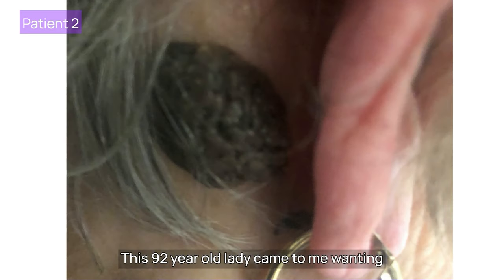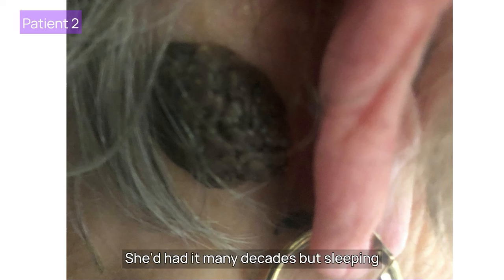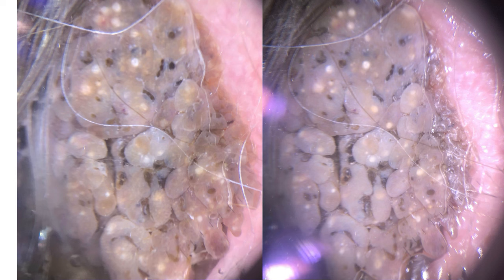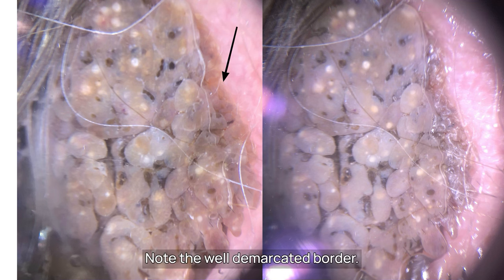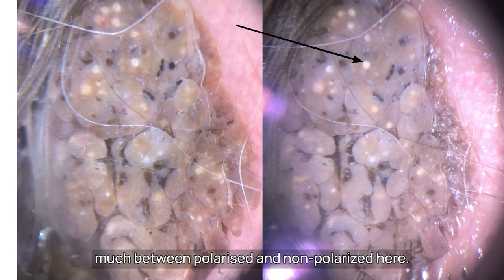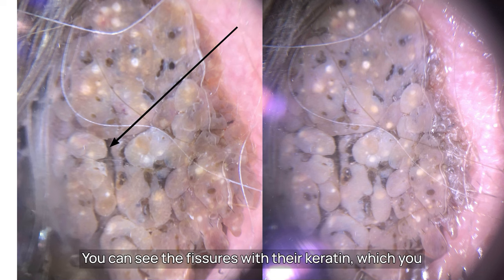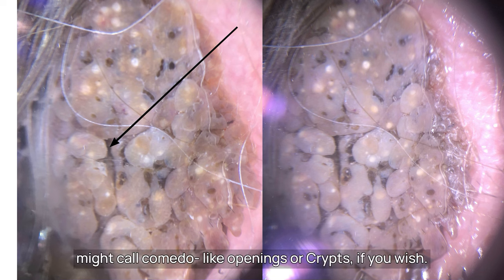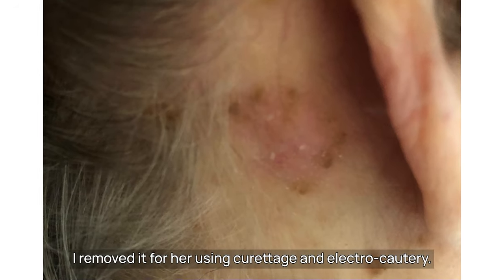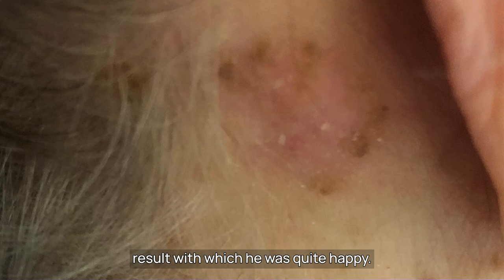This 92 year old lady came wanting this 3cm soft fleshy lesion removed from behind her right ear — she'd had it many decades, and sleeping on that side was now uncomfortable. Note the well-demarcated border. The little white and yellow dots are milia, though they don't change much between polarised and non-polarised here. This is a very mature seborrheic keratosis. You can see the fissures with keratin — comedone-like openings or crypts. On histology it was confirmed as a seborrheic keratosis. I removed it using curettage and electrocautery, and two months later she was quite happy with the result.